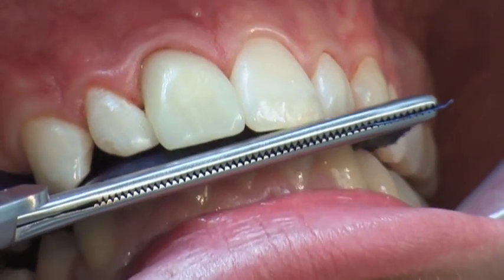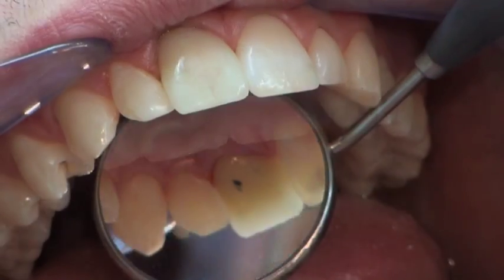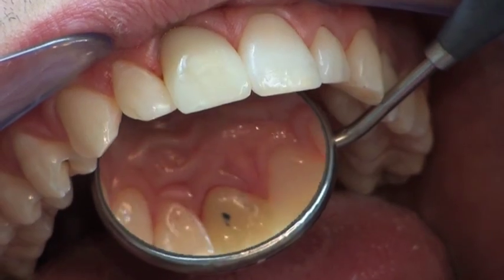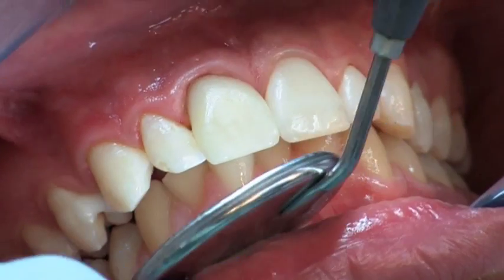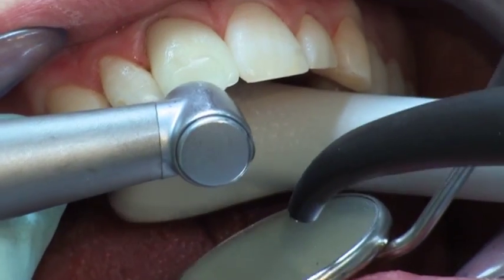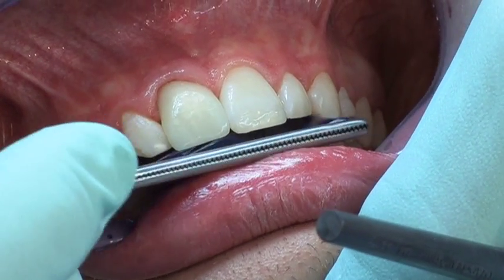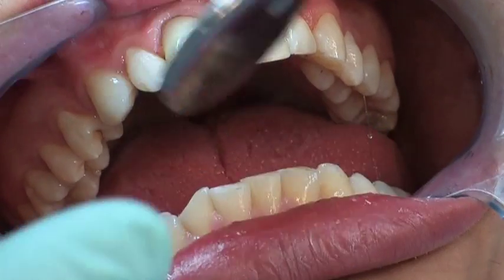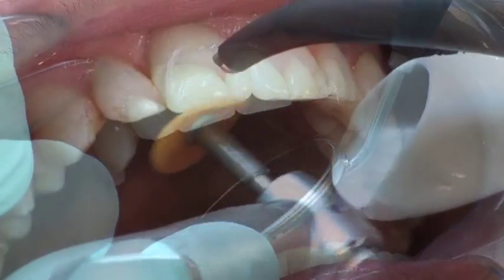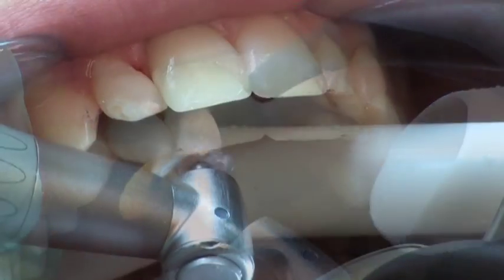The occlusion is thoroughly checked afterwards. High contact points are removed and the surface is polished to a high glossy finish.